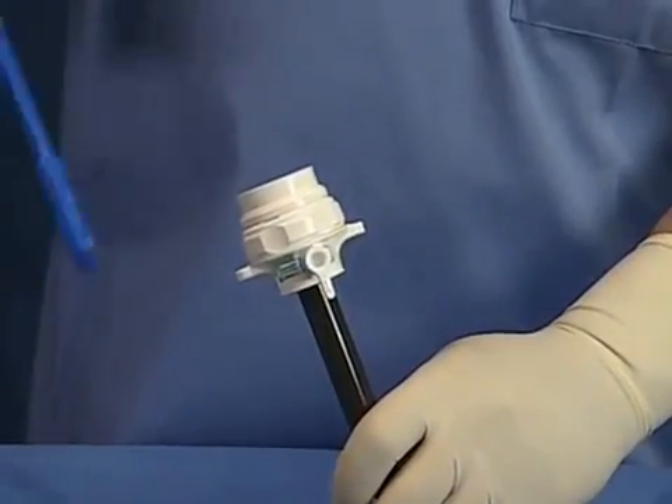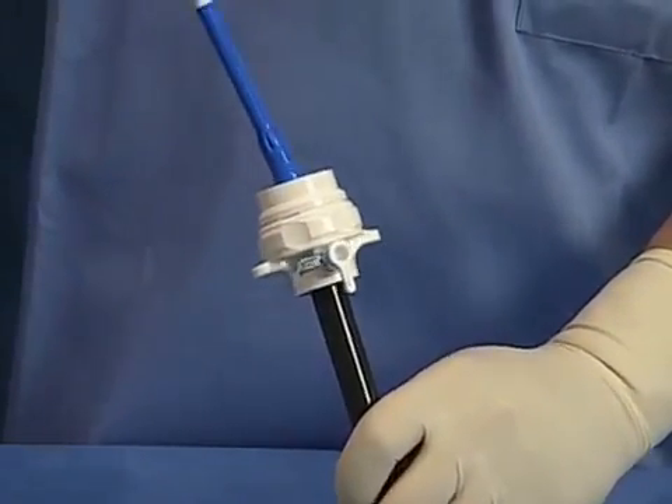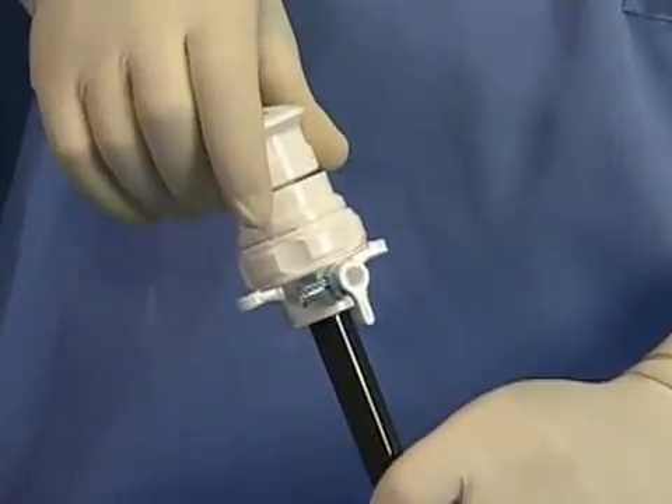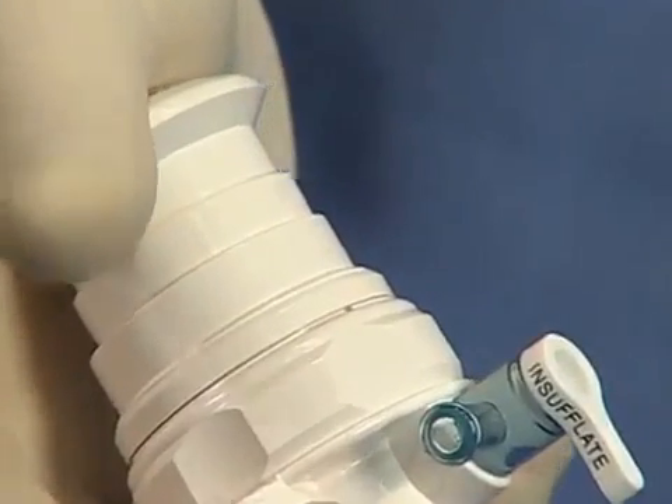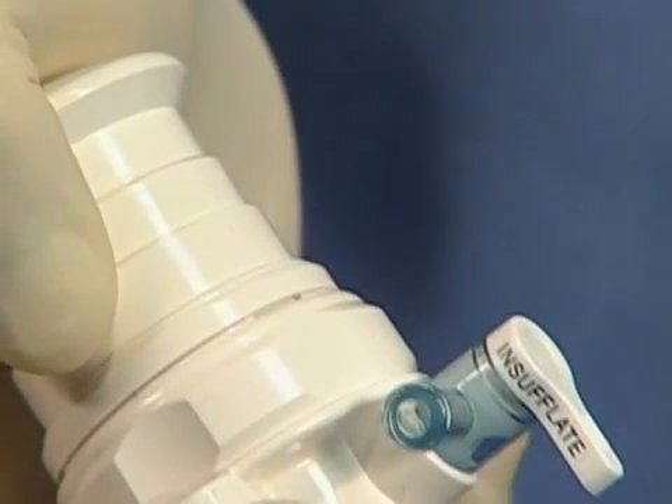To insert the Trocar, place the instrument in the palm of your hand and squeeze the housing and cannula assembly together with the obturator. It is critical that you maintain the squeeze action and use a constant downward force during Trocar insertion.